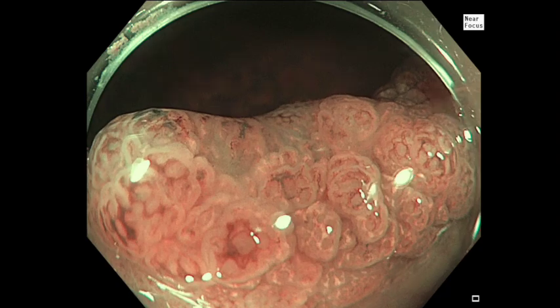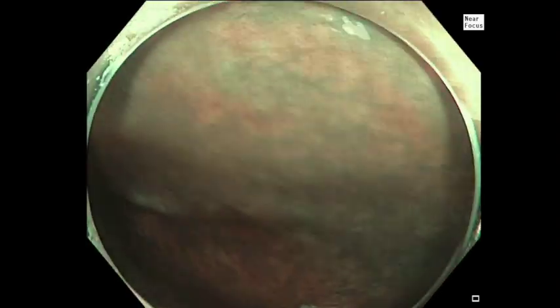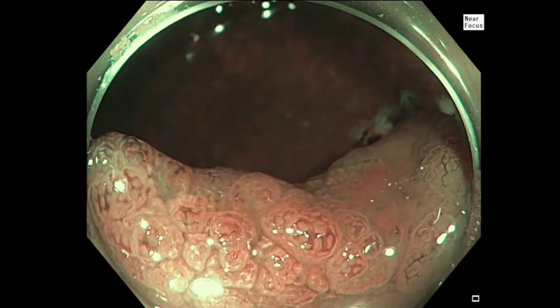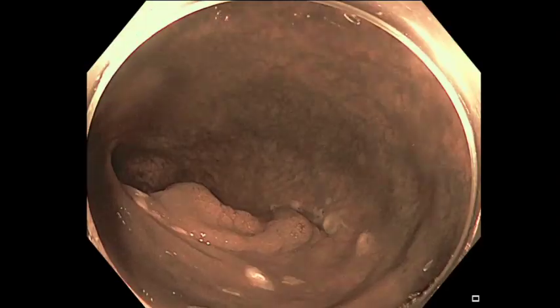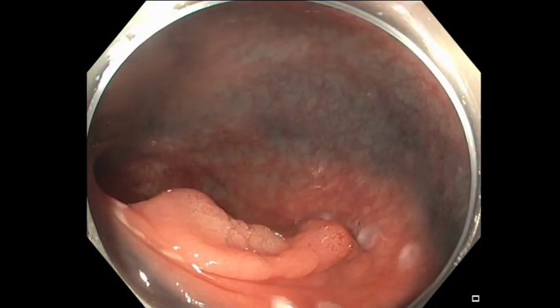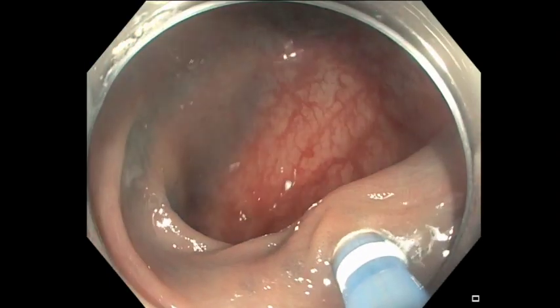You can see here a granular lateral spreading polyp in the descending colon, and you can see how it's in a slightly unstable position, but we're using a device over tube, a rigidizing over tube, for stability. And you can see here with NBI, there's increased vascularization and possibly high-grade dysplasia.